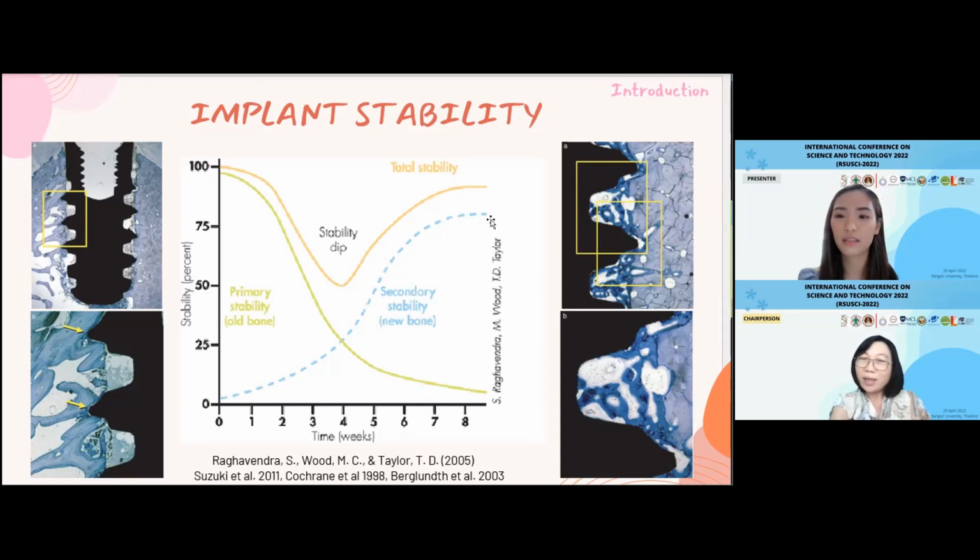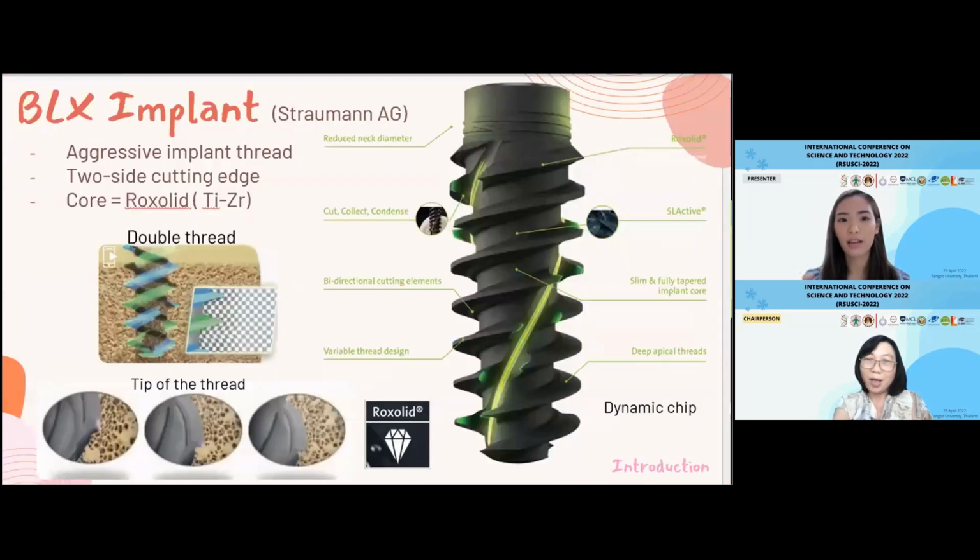Do you have any problem inserting this kind of implant in dense bone in your research? I think there is not much problem, because the thread has a cutting edge for engaging. So the torque of this implant may be more than 50 or 70. I'm not sure, I want to check again, but maybe 70, because the old version, like DL, could only take 35 and the fixture mount would break, but this type has higher torque. We can insert it.